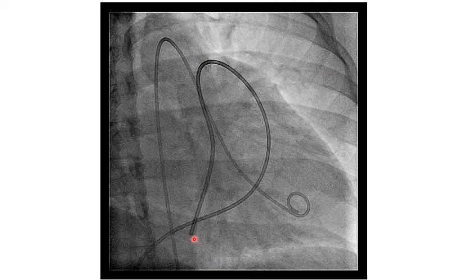So three points are important. One, the catheter tip is fixed. Two, the arterial pressure wave pattern changes to a venous pressure wave pattern. And three, when you withdraw blood, you get 100% oxygenated blood. And you can also look at the respiratory variation. When the catheter is wedged, we will have respiratory variation. Okay, very good.